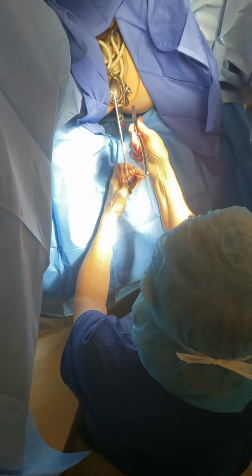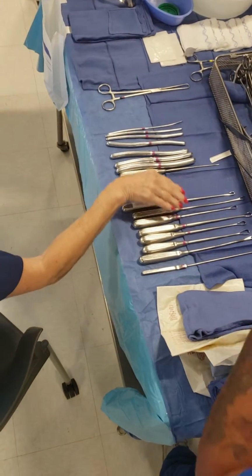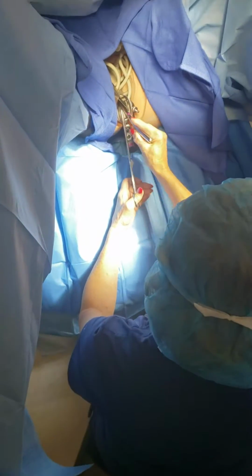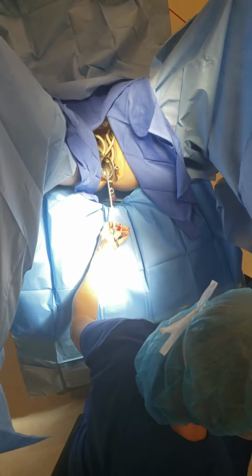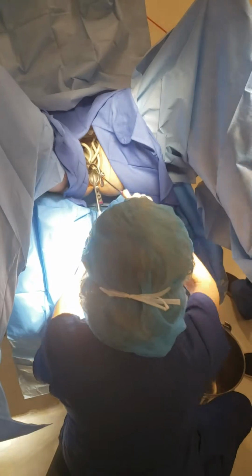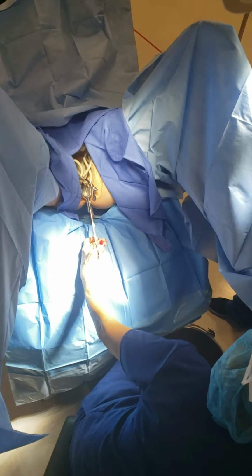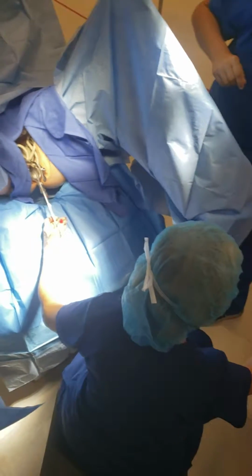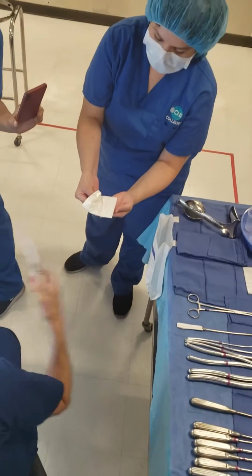How do they know when to stop? They can feel, and they can see how big around. Because they really just need to put this in there. Do they put any medication to help her dilate? No. Any numbing medication? She has anesthesia. It's a tiny one. Okay, then I'm going to scrape, and then the scrub tech is gonna be holding, here Myra, you're gonna be holding that out. Your hands are gonna be underneath, not on top, there you go. But you can take your thumb and go over, there, to help me get it off.